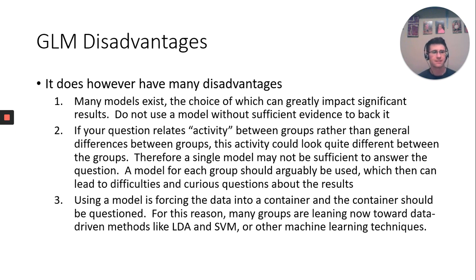Well, activity is specific. So you would have to model your 90-year-olds separately. You get beta values from that model. And you have to model your 6-year-olds separately and get your beta values from those, and then you would compare. That's kind of screwy because you can favor your populations and you can really use that to your advantage and not be too honest about that really easily.